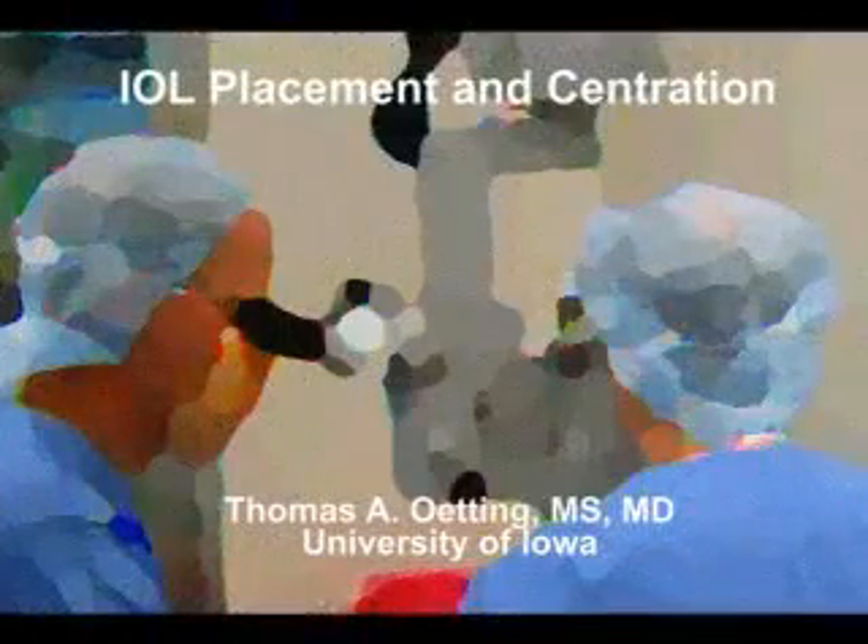So we've shown several examples of how to place an intraocular lens and several examples of problems placing an intraocular lens, and I hope this was useful to you. Thank you.